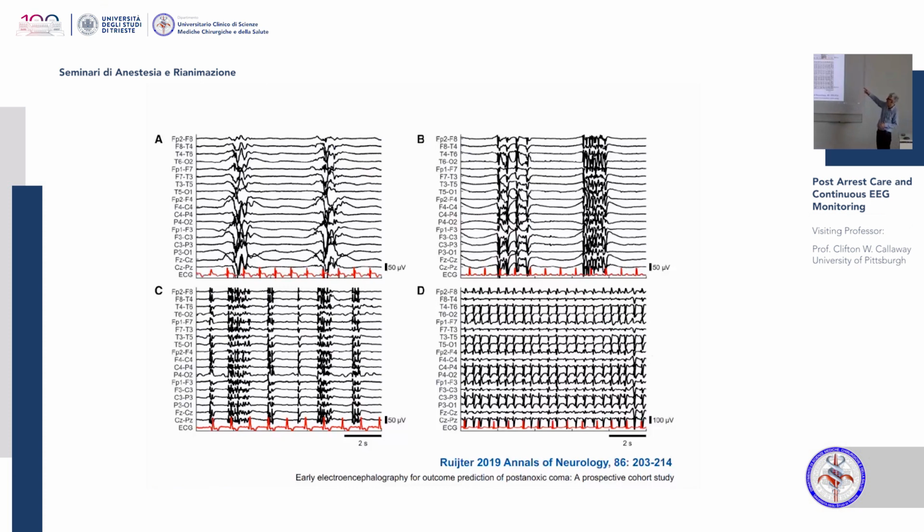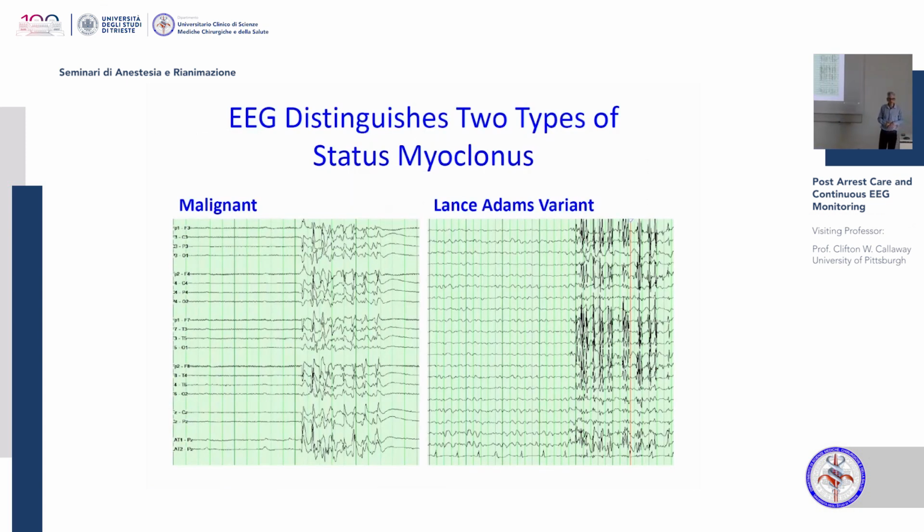Here, you can see that all those bursts look alike. And then they may evolve into that seizure. Again, that's Hoffmeyer's data. And it may or may not have background brain waves behind it. This, I think, if I had to think of the thing we came to understand the most from EEG in the past 10 years, this is the thing I think is the most important thing we've observed in cardiac arrest patients in the past 10 years.